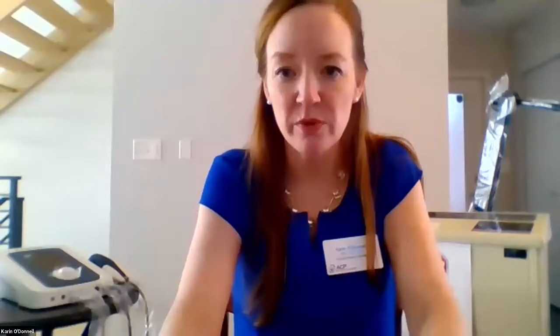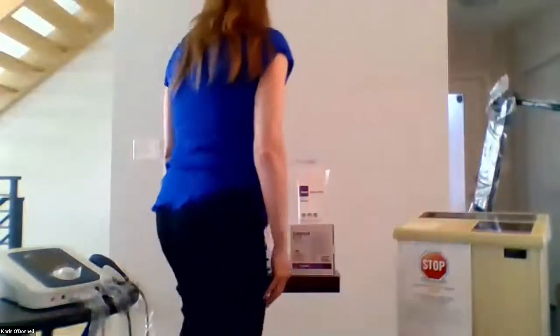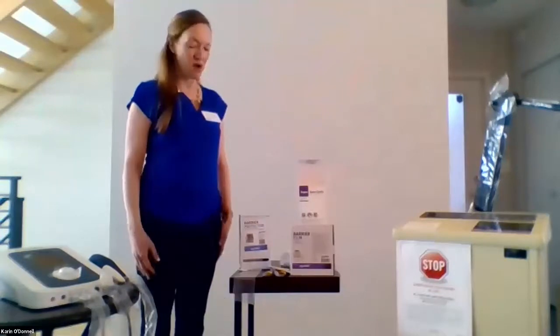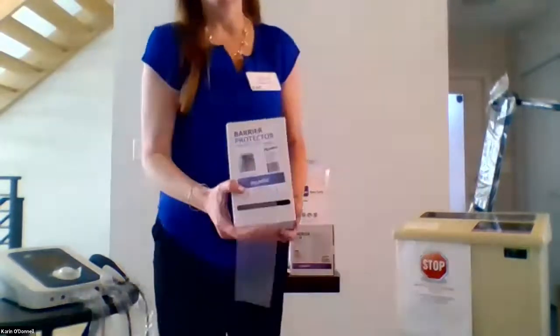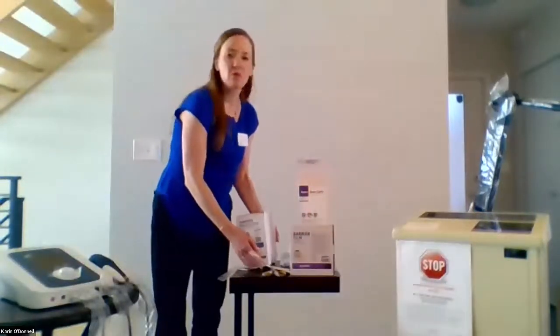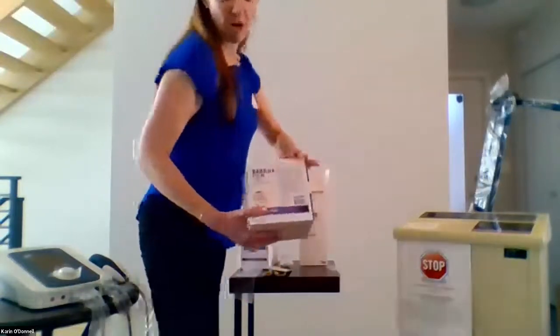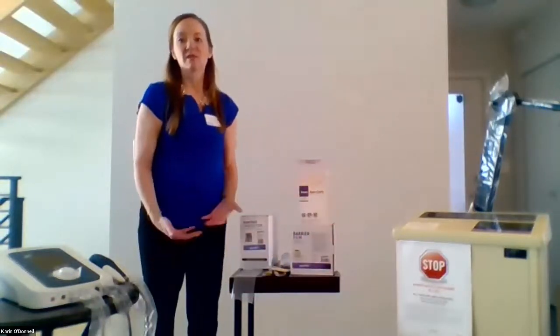Now we're ready for the demonstration portion of today's webinar. First, I wanted to review the supplies that ACP has to offer in terms of infection control. We have our protective tubing, which is used to thread your lead wires through any type of cords or cables. Next, we have our barrier film, which is used to protect any portion of the equipment the therapist might need to touch during treatment, such as the control panel.